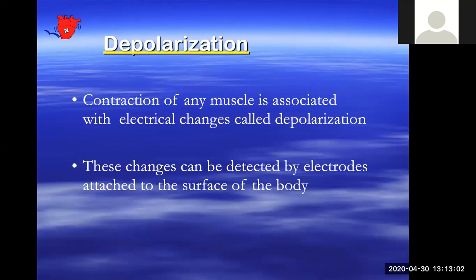As I said, the ECG reads the electrical activity. The electrical activity is the depolarization. It's the electrical activity before the chamber, whether atrium or ventricle, contracts.